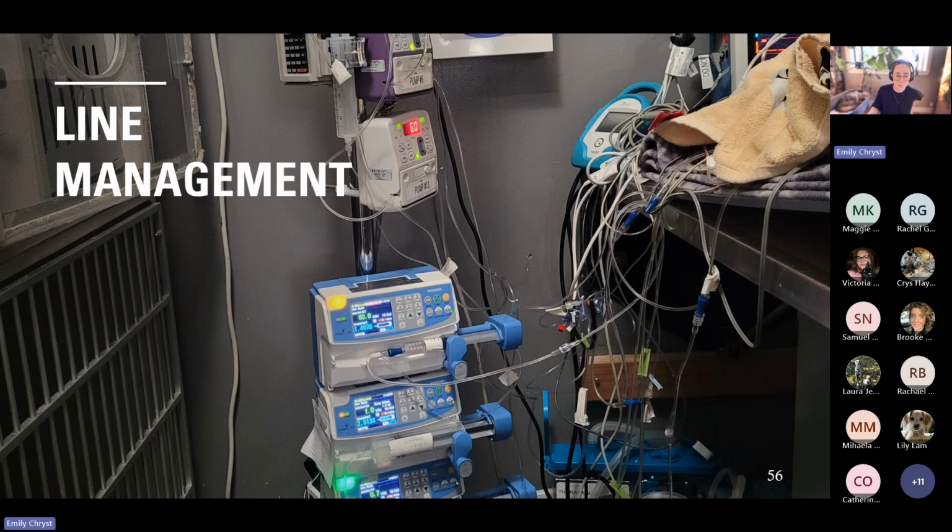There are better options. Now, I think those little orange shoestringy things have a trade-off. They're not going to harbor bacteria, but if they're tied tightly, and endotracheal tubes should not be cinched in. These patients shouldn't be moving a lot. In fact, most of the time, if I'm directly with a patient, they're very, very loosely tied. But those little orange guys, I've seen them cut into the commissures and cause little Joker smiles or Glasgow smiles on patients, which is no good. So you can buffer that with a piece of glycerin-soaked gauze, which can help.